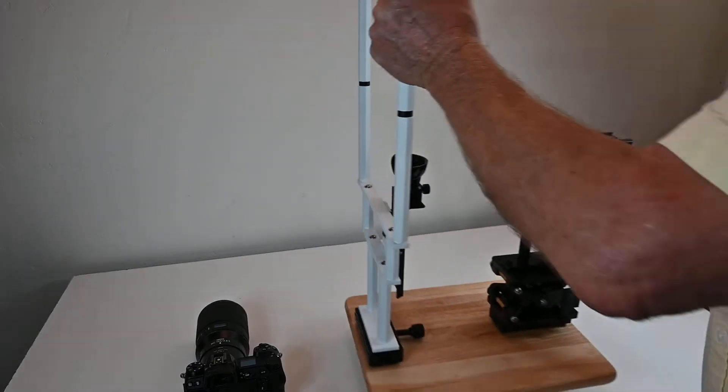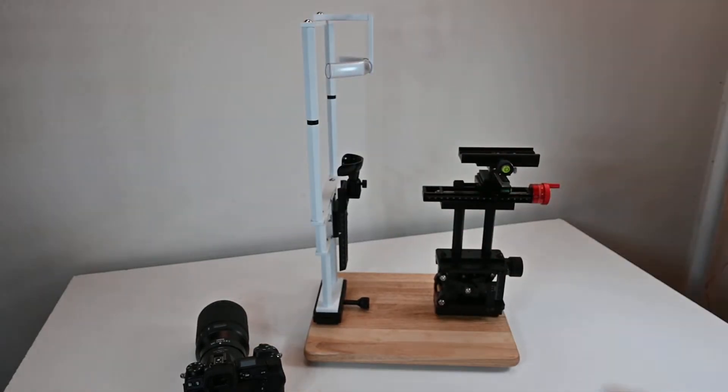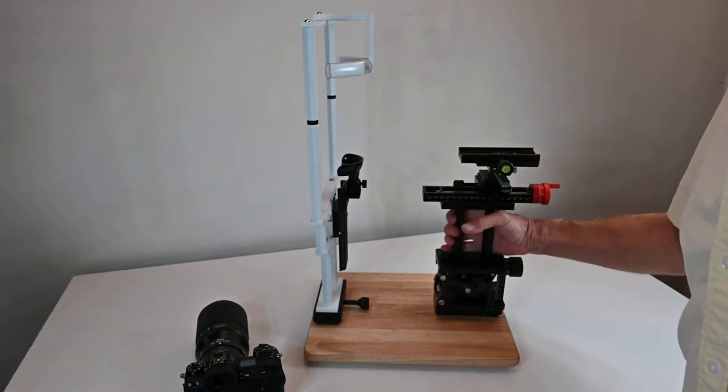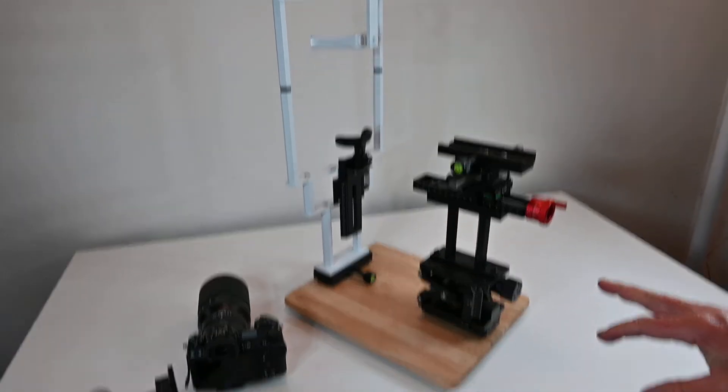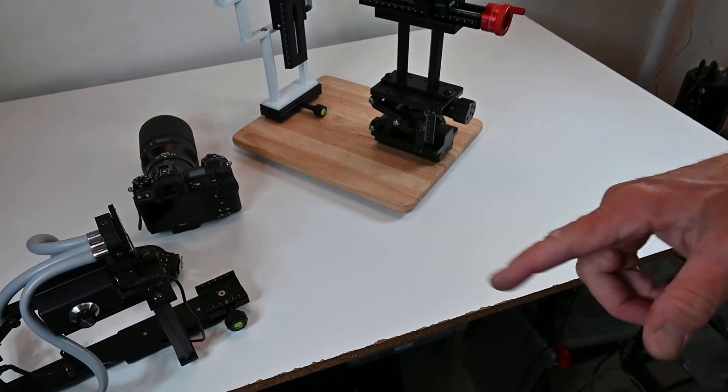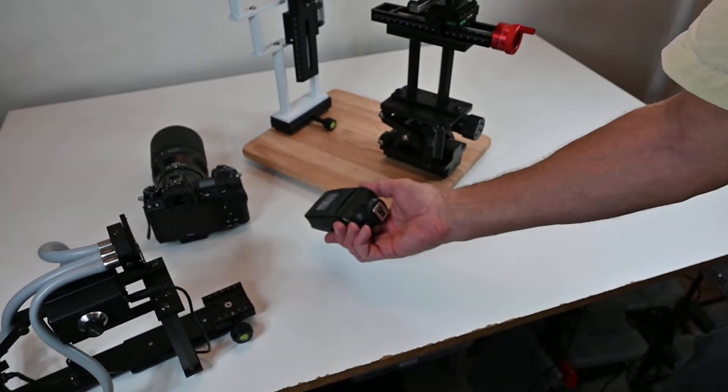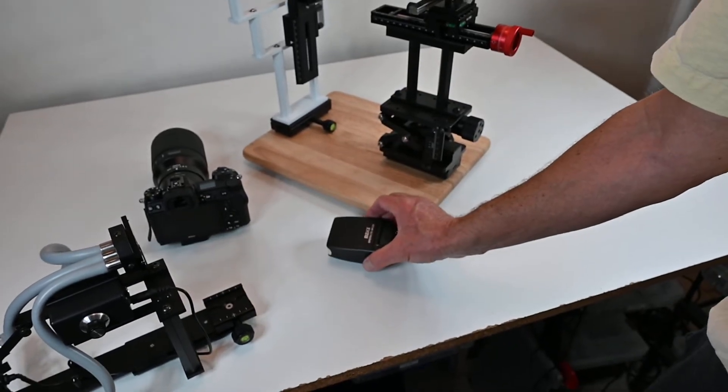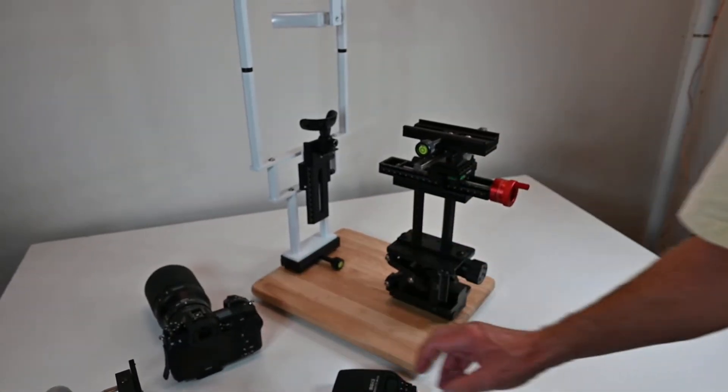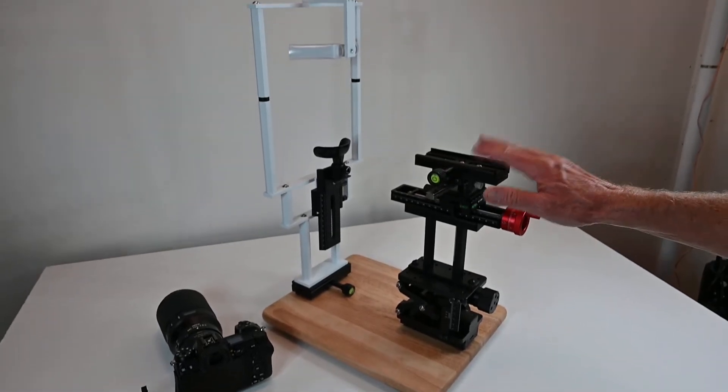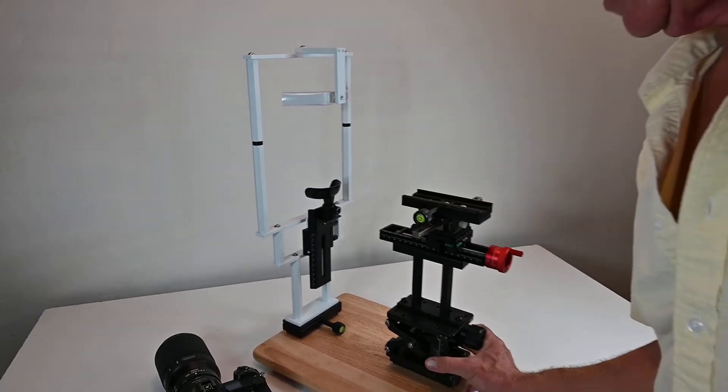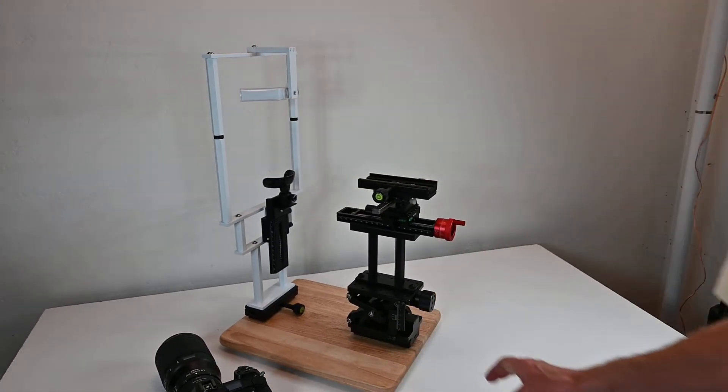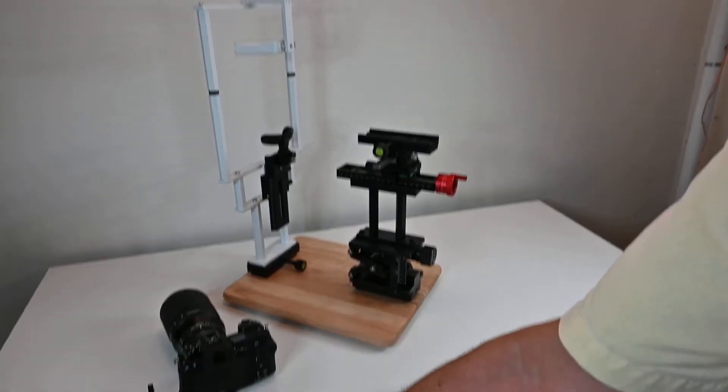The second part is the chin rest, which is shown how to assemble in a separate video. The first step in assembling is just these four components: the illuminator, the external flash, and the camera. Those are the three photo components and then the chin rest.